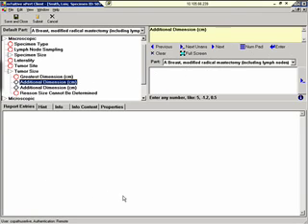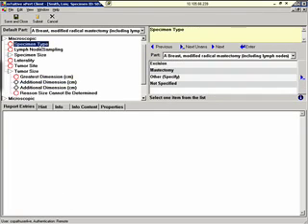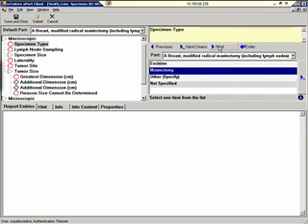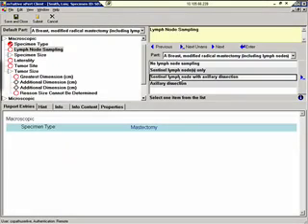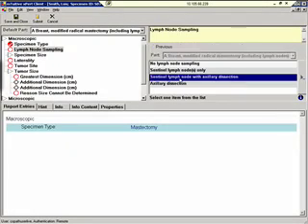At the bottom of the screen, a report actually builds as you enter information into the system. This is where the information you enter is displayed. We'll discuss the functionality of these tabs as the presentation progresses. We'll begin by selecting the specimen type. Mastectomy, lymph node sampling. We'll select sentinel lymph nodes with axillary dissection.